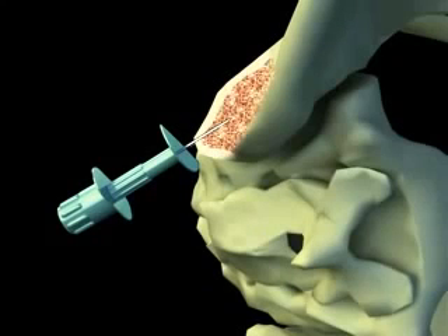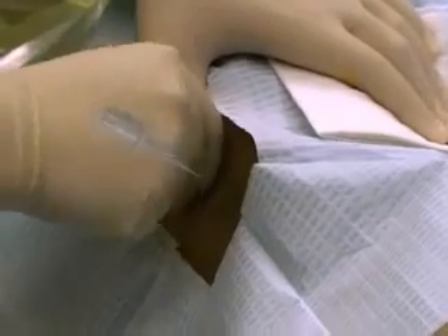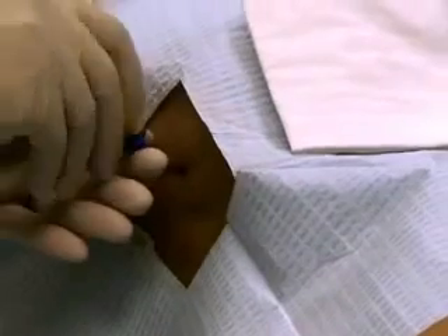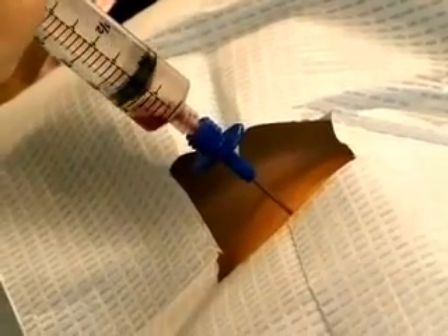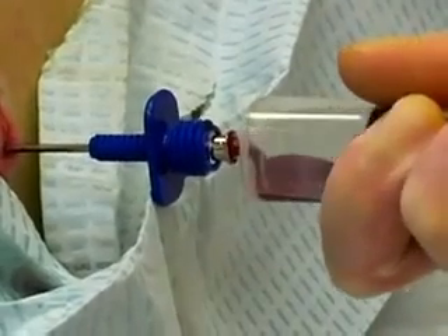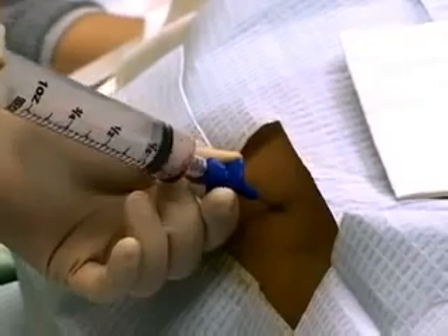The ilium is a large bone and the marrow space should be located easily. However, the angle of entry is important. In general, the needle should be advanced at an angle completely perpendicular to the bony prominence of the iliac crest. Once the needle is through the cortex and the marrow cavity is entered, the needle should stay in place without being held. Next, remove the stylet. Attach a 30-milliliter syringe without heparin and aspirate 1 milliliter of marrow with a firm pull. Since the aspiration itself can be particularly painful, it is prudent to warn the conscious patient before you aspirate.